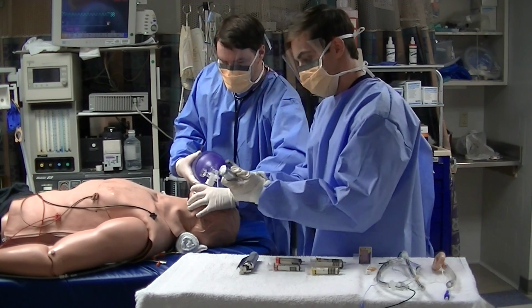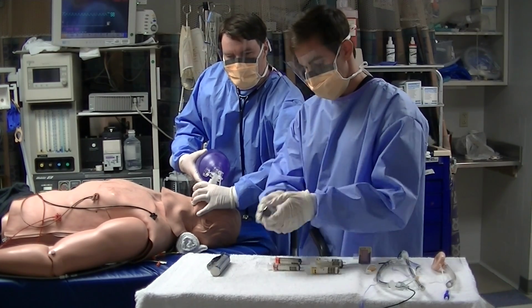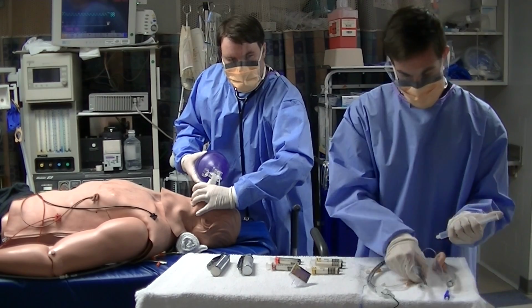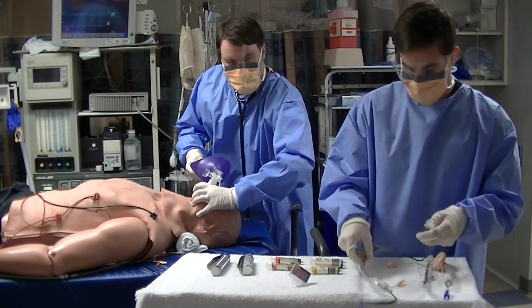The provider then checks his laryngoscope blades to make sure the light source is working adequately. Note that he has not just one, but a backup blade as well. He then checks both of his endotracheal tubes and inflates the cuff of both tubes to ensure that his equipment is functioning properly.